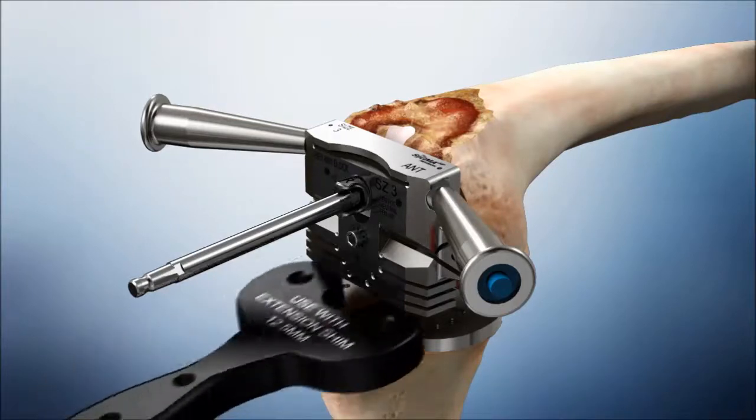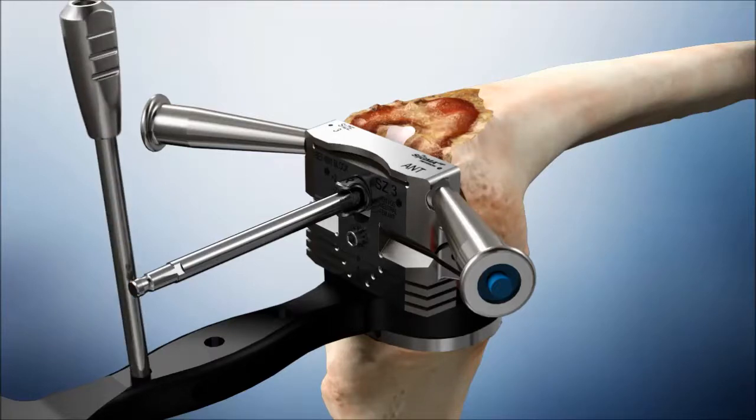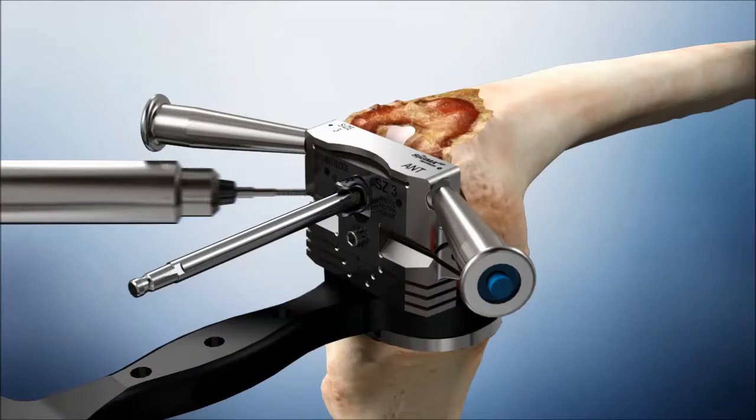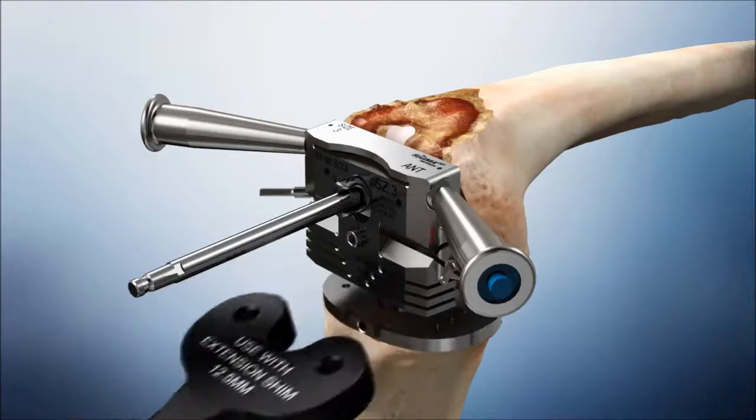Use the HP Revision MBT spacer blocks to set the rotation of the revision 4-in-1 cutting block. Alignment rods may be introduced through the handle of the spacer block to aid in assessing alignment. With rotation and gap balancing confirmed, secure the cutting block with the HP removable headed pins through the convergent pinholes on the side. The pins will pass through the block and then through the distal spacer as shown. Remove the spacer block and removable handles.